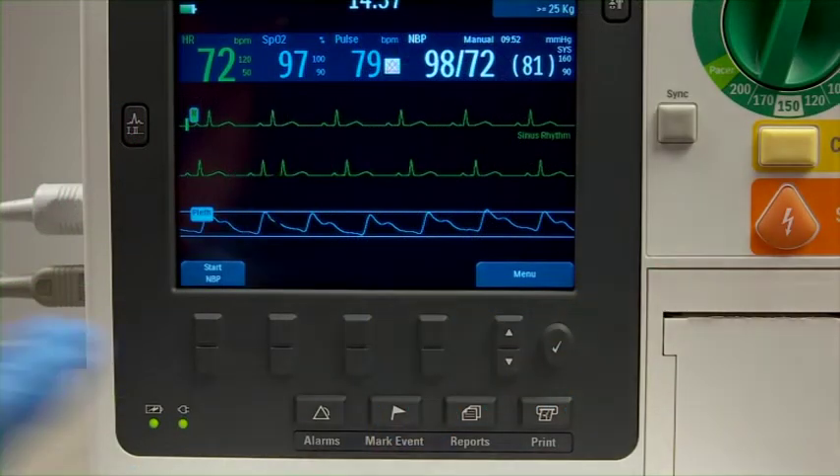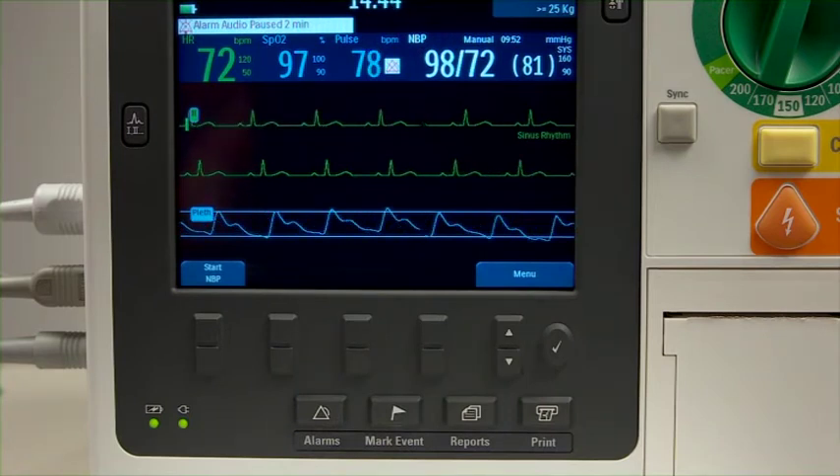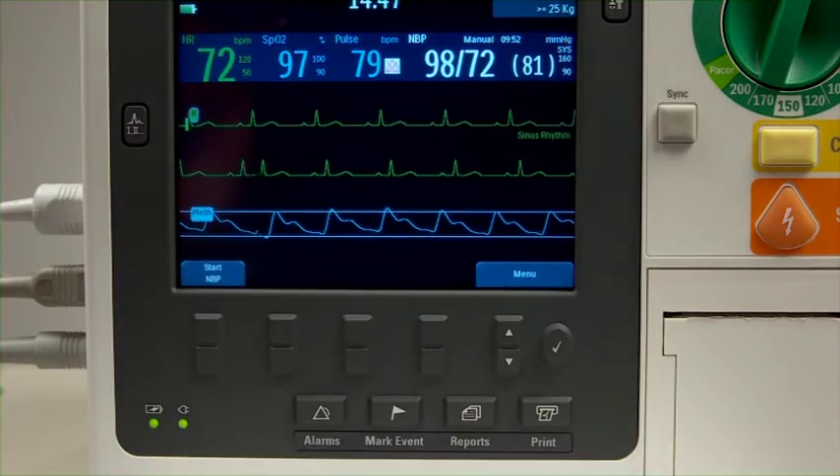This is the alarms button. It pauses all audible physiological and technical alarms for a configured time interval. Press it again during the pause interval to return alarms to their previous settings.